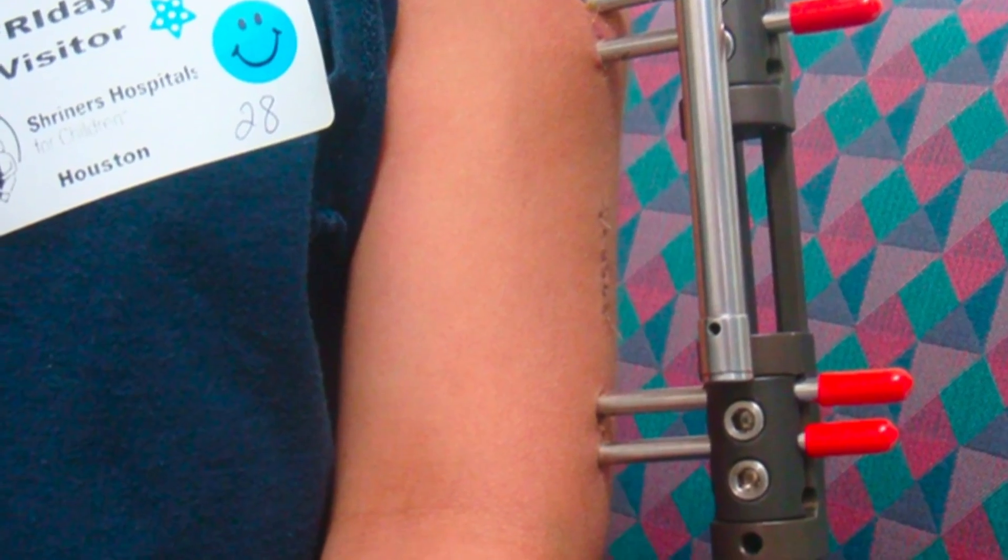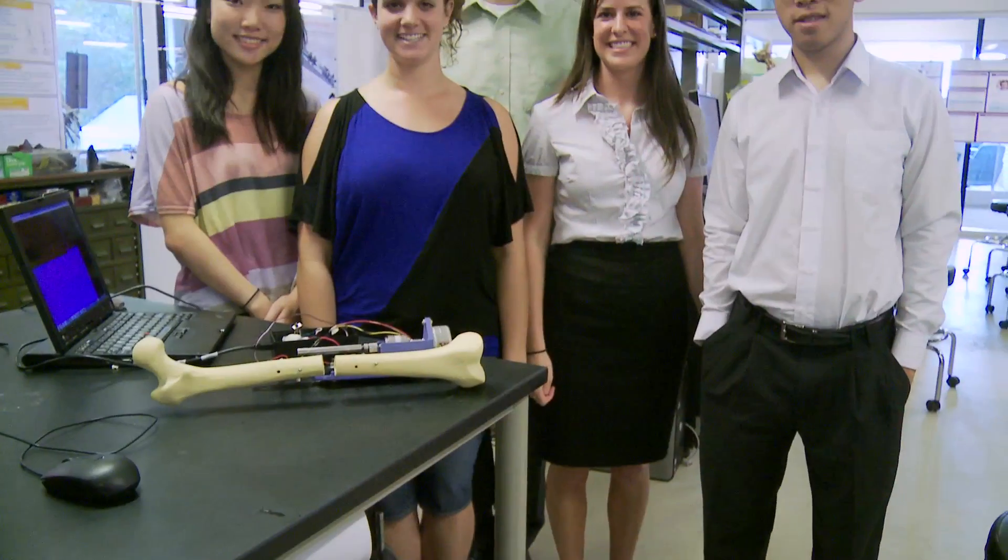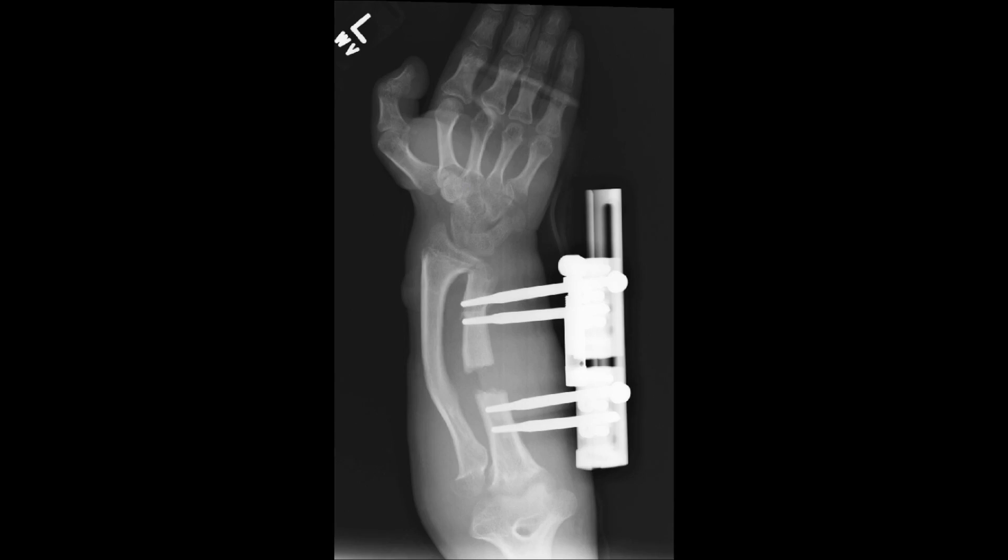The current procedure for doing that is called linear distraction. We are team Break and Make, and Break and Make comes from the process of making the bone longer. You surgically fracture it, you break it, and then you make it longer by slowly pulling it apart.